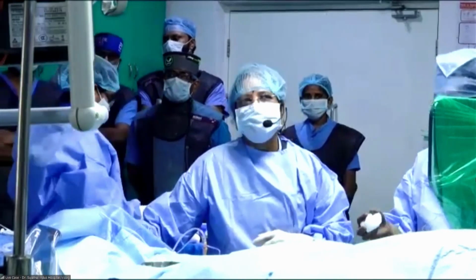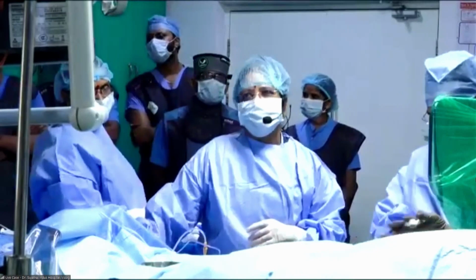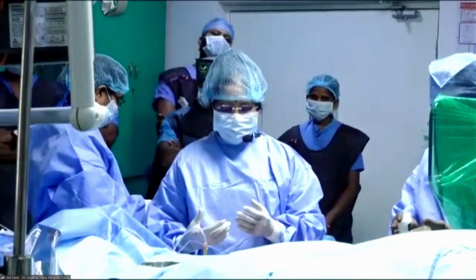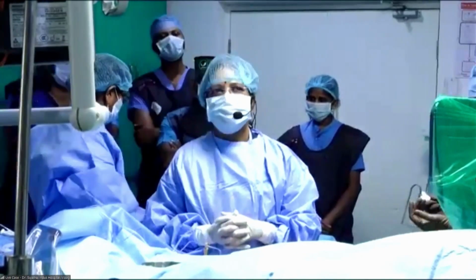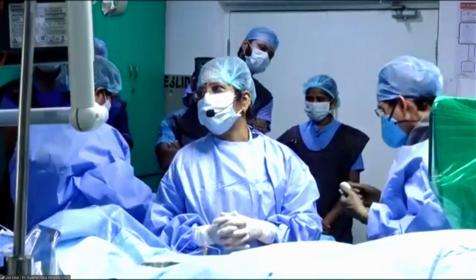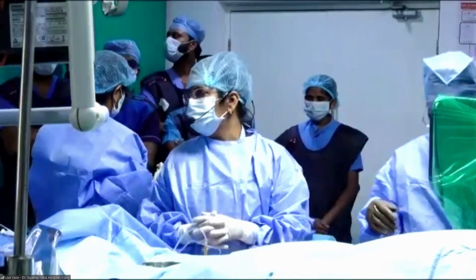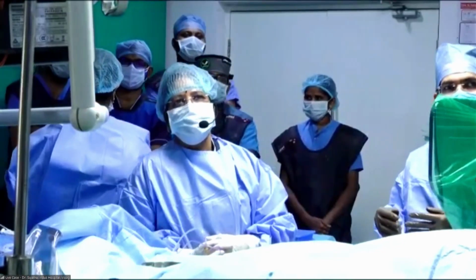Thank you, sir. Thank you very much for the inputs, and thank you for making me prepare the lesion, because most of the times we are in a hurry to put the stent in. But Dr. Ramesh has pulled me back, made me dilate again. I went up with the 3.5, and now you can see the beauty of the MSA which I got, which is 6.9.